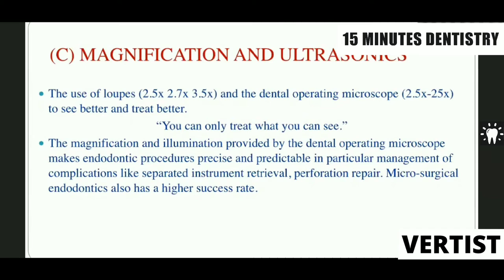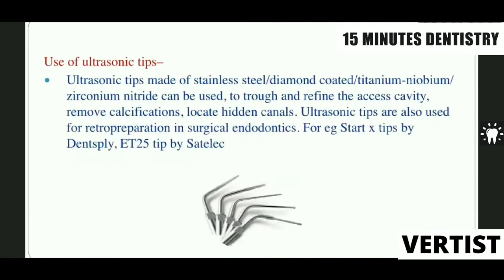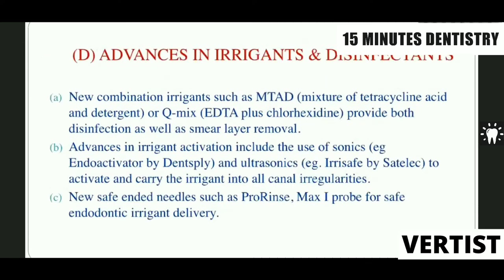about and are very intrigued and maybe very fascinated by, this magnification, use of microscopes in endodontics. So we have the loops and all the procedures that we are carrying out under magnification. Use of the ultrasonic tips is very important, which we use for access opening. These are the tips which you are seeing here, ultrasonic tips which are used for the initial access openings and for your surgical procedures. And let us move on to the advances which we have in irrigation.